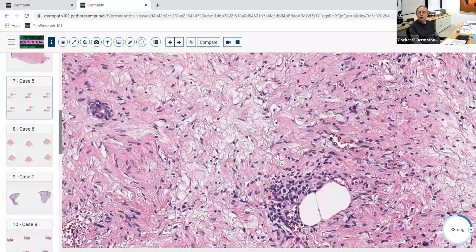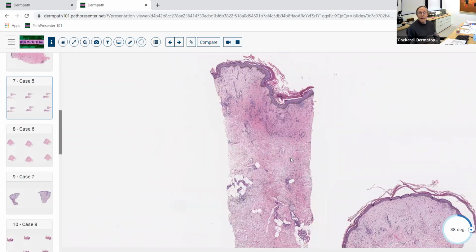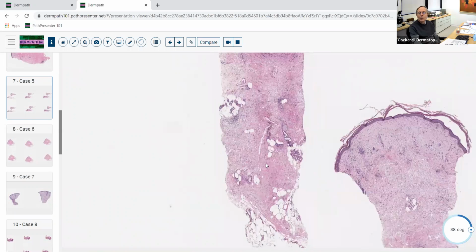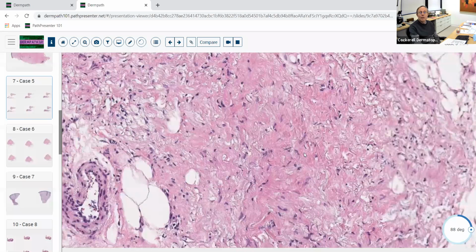And you've also got the squared off biopsy. So this isn't normal dermis. If you were to see a patient that has this condition, their skin feels very thick and looks kind of thickened, almost with an amoeboid appearance to the little rippled pattern on the surface. And this is not sclerosis again, it's fibrosis. This is nephrogenic systemic fibrosis. So here you've got an increase in the number of fibroblasts.